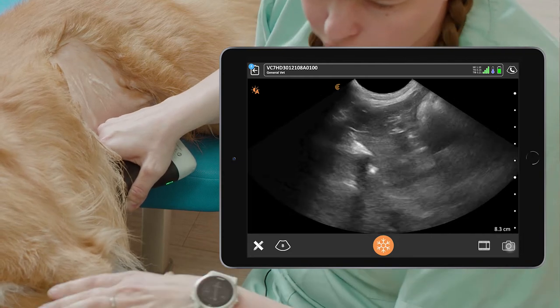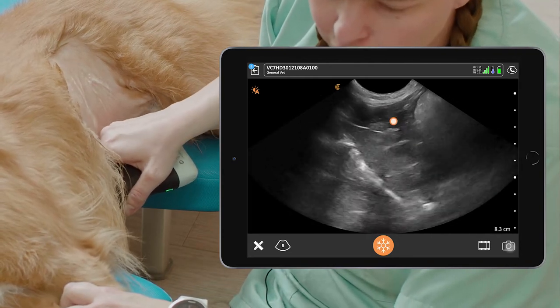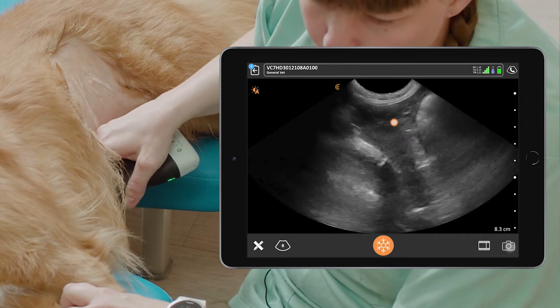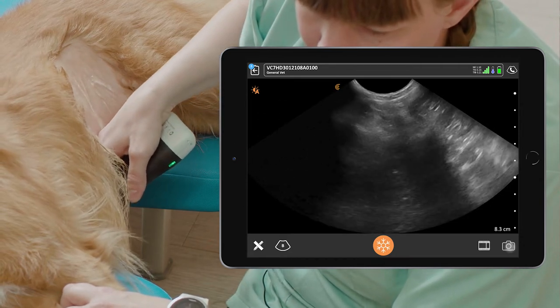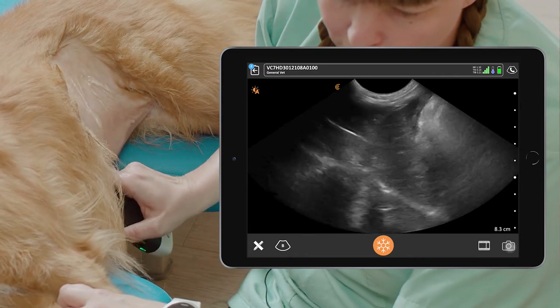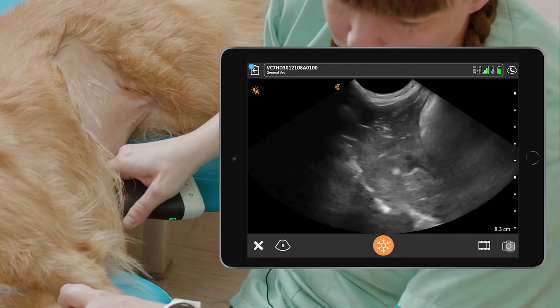We want to get the whole liver on the screen, including the cranial part of the liver, and then we fan all the way down until we lose the image, and then we fan all the way up again until we lose the liver in the image.